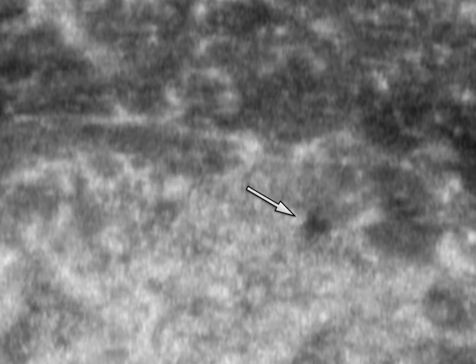So how did we find this cancer? It was diagnosed on a 3D ultrasound that we performed here at the clinic. We performed the ultrasound because we knew that this woman had dense breast tissue and therefore was at a higher risk of having a missed breast cancer. Can you see it? Here it is. On ultrasound, cancers show up as dark areas, whereas the surrounding dense breast tissue is white. Ultrasound interpretation is not affected by breast density.